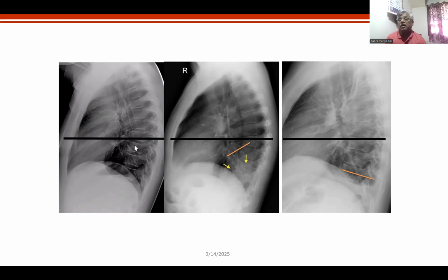Posterior mediastinum, often the masses that you get are consolidations or of neural origin, neuroblastoma and other things, or even skeletal, etc. Understand? The middle part is mediastinum, and whatever you get is often hilar. All structures, vessels, lymph nodes, etc. in the hilar. So this is very, very important for you to understand the mediastinal lesions.